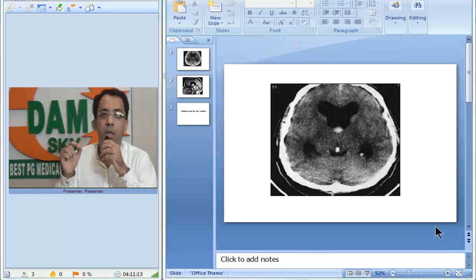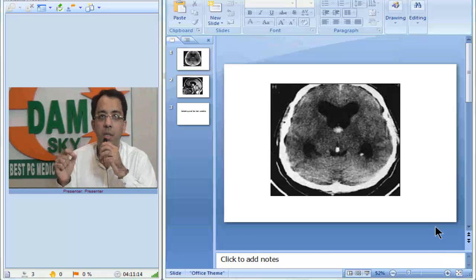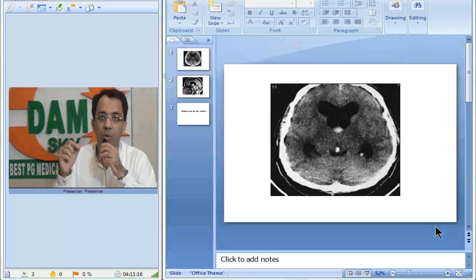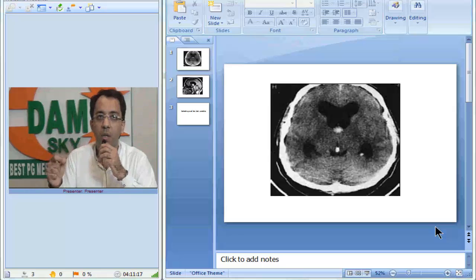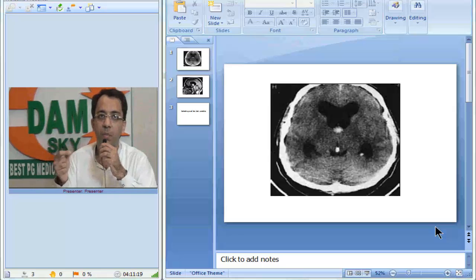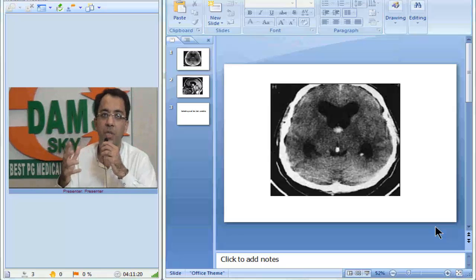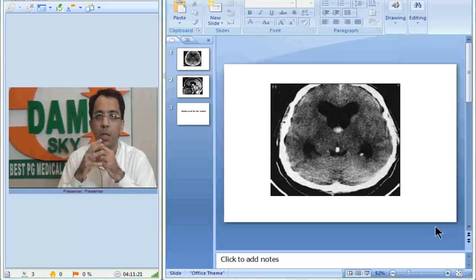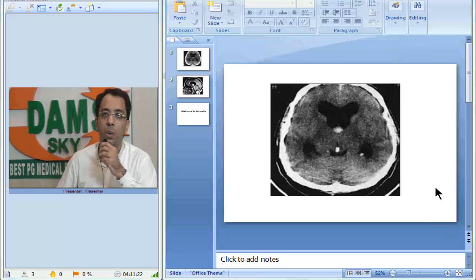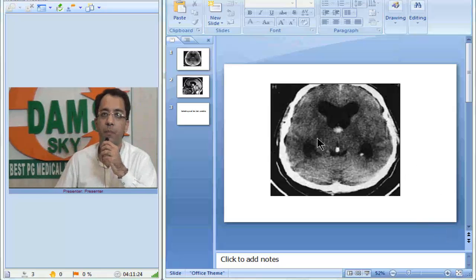Hello everybody. Now we will discuss an interesting case. I will show you a CT image and MRI image of a patient who presented with sudden headache. Now I want you to look at the CT image.